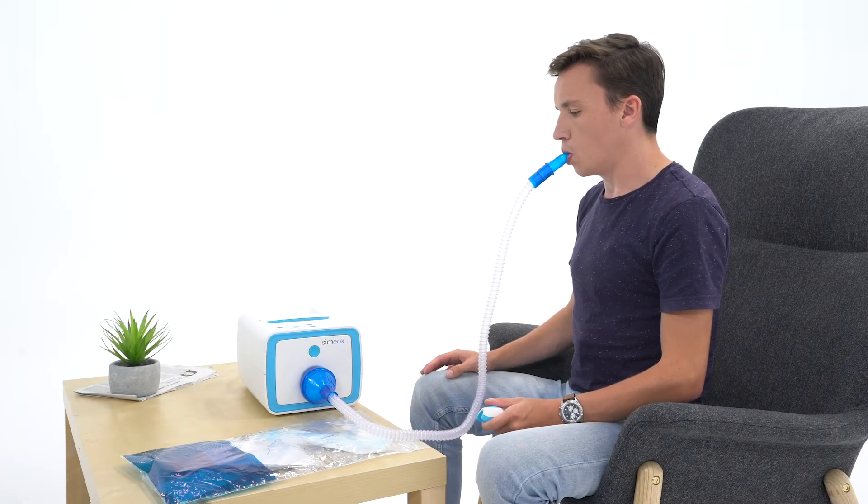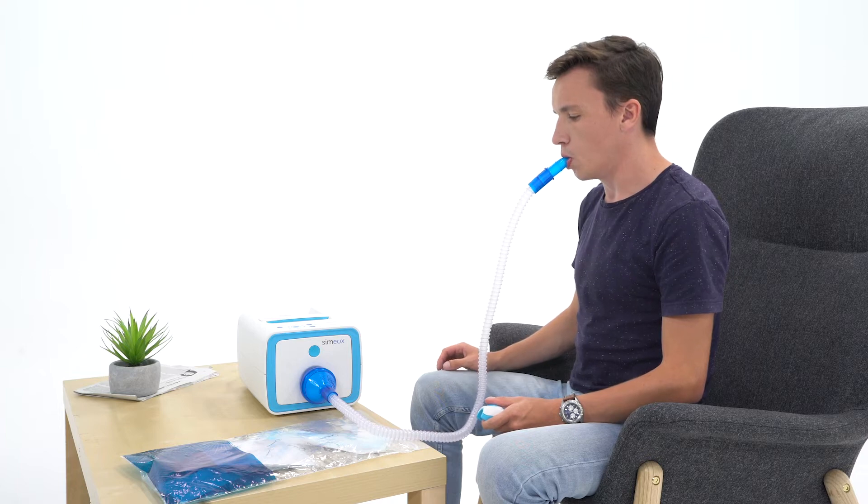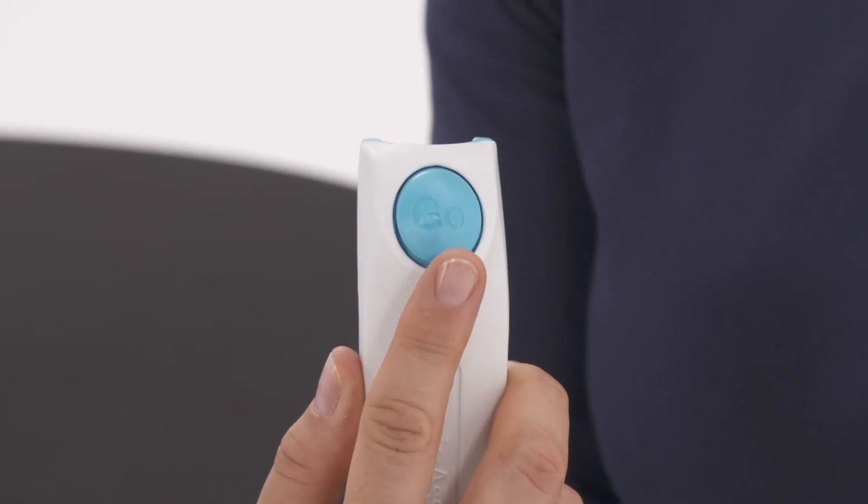When the patient is ready to exhale, he activates the SEMIOX signal by pressing on the go button of the remote control.